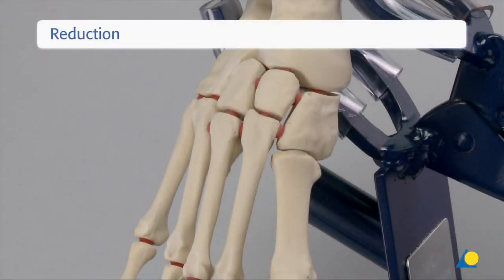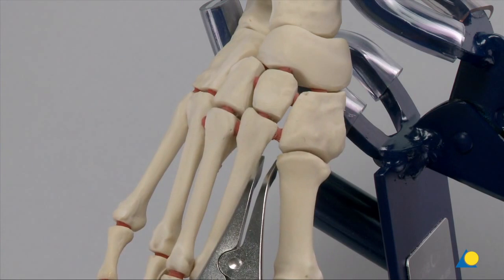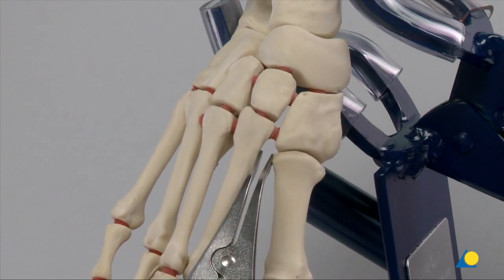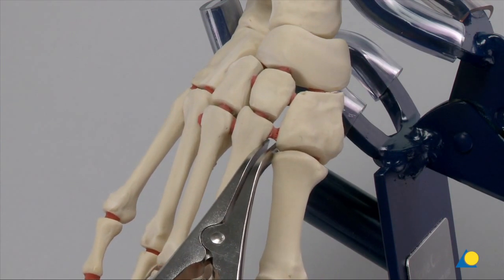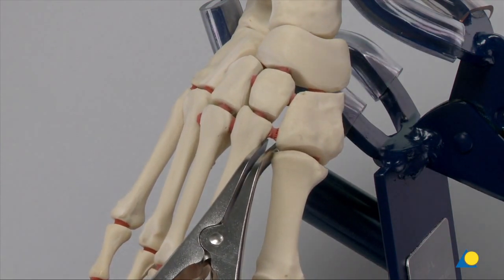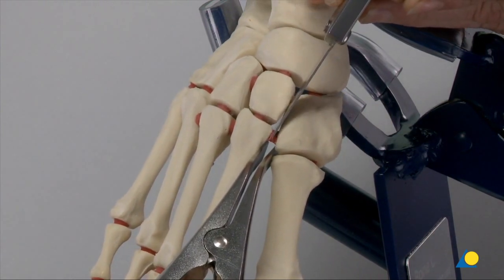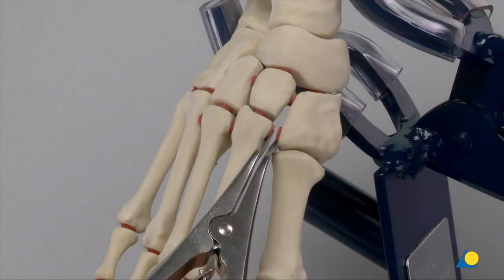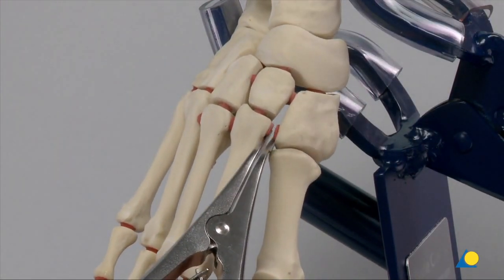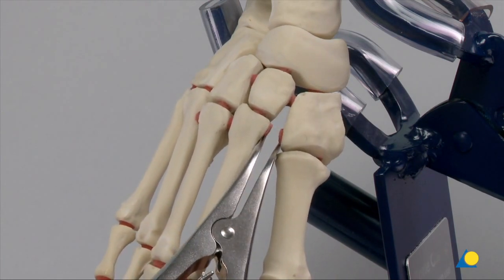The bone model is secured in the clamp. The bone spreader is used to show the simulated medial column instability between the first and second metatarsal. The simulated attachment is stretched. The chisel is used to release this simulated attachment. The simulated intertarsal instability and instability of the base of the second metatarsal from the medial cuneiform can be seen.